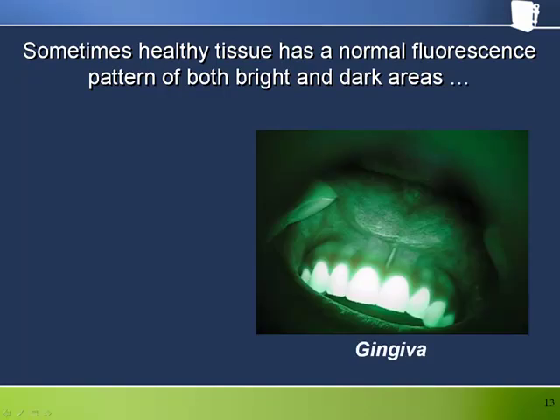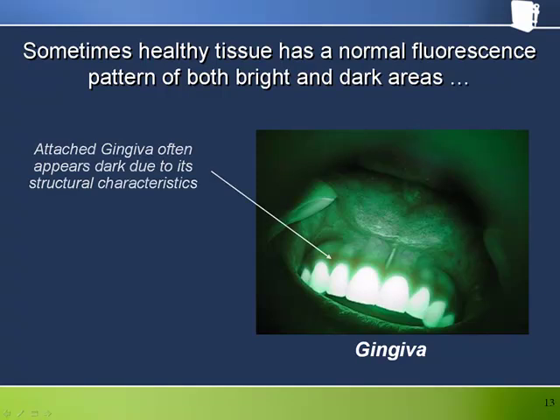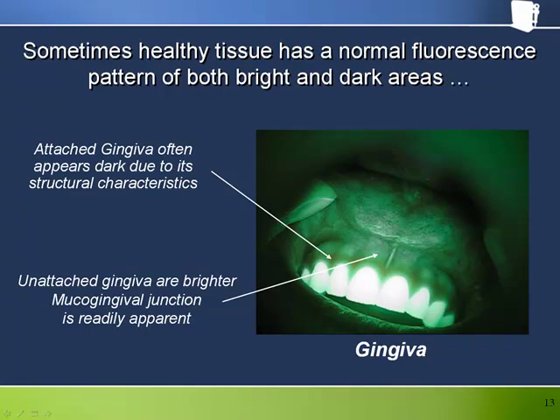Some oral mucosa appear homogeneously dark under Velscope due to their structural characteristics. A good example is the attached gingiva, which while having a typically light pink appearance in white light, appears dark under Velscope. The unattached gingiva immediately adjacent to the attached gingiva have a brighter appearance, more typical of other mucosal tissues, making the mucogingival junction readily apparent under Velscope. The theme of symmetry and bilateral presentation is again evident here — this principle is one of the keys to helping us decide what belongs and what doesn't.